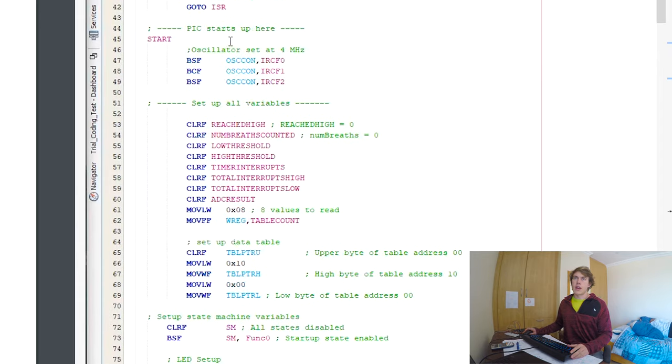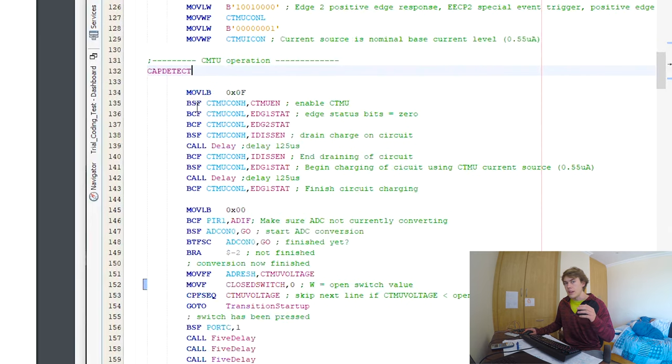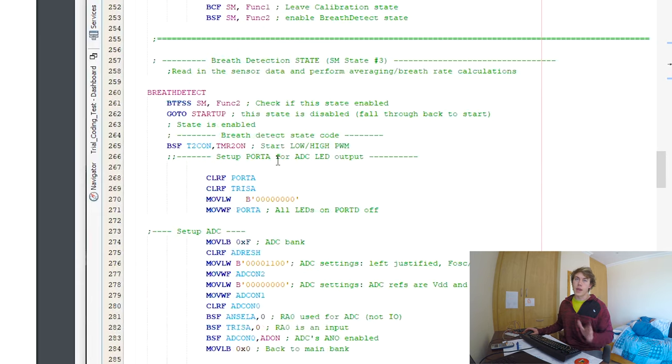The microprocessor starts up here, sets a whole lot of registers needed to set the oscillator at a certain speed — that's how fast the processor runs. It sets up variables and state machine variables, then we enter the startup state. From there we go to the capacitive detecting to see whether the capacitive touch sensor has been touched to start the system. If it hasn't, we stay in the startup state. If it has been touched, we transition into the calibration state, where the ADC measures the voltage on a certain port when the button is pushed and when it isn't, and from that decides whether to set the high or low threshold for the button press, so the software can distinguish a high or low press.